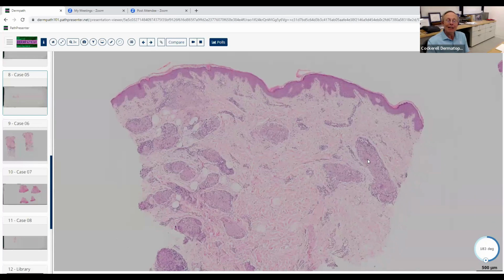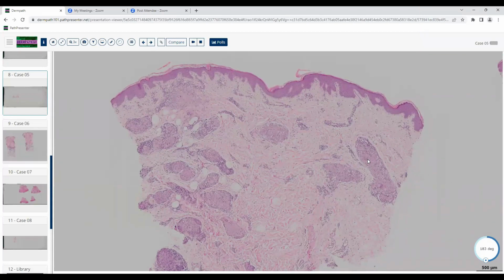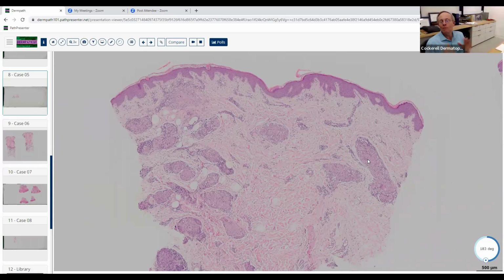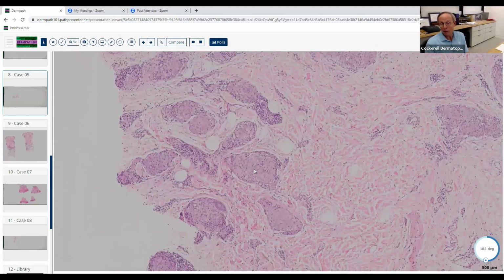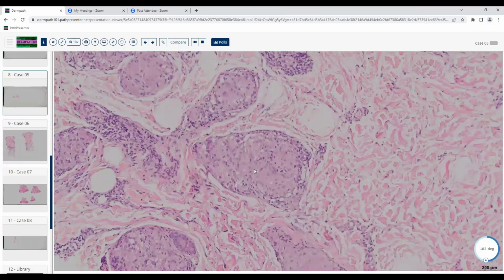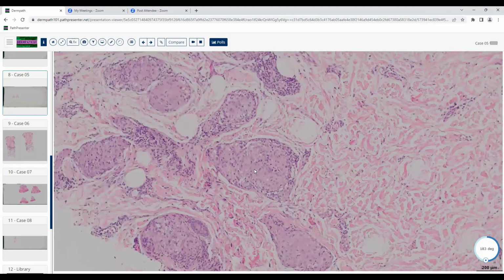So now, what if they didn't have sarcoidosis as a choice? You look at this, you say, sarcoid, it's got to be. No way that it could not be. And you look down there and lo and behold, it's not there. What are you going to look for as other possible choices that can give you a sarcoidal granulomatous dermatitis that's not sarcoid? Leprosy. Good. Very good.